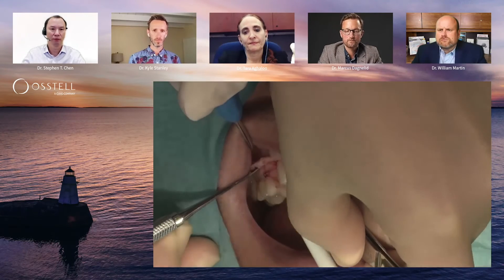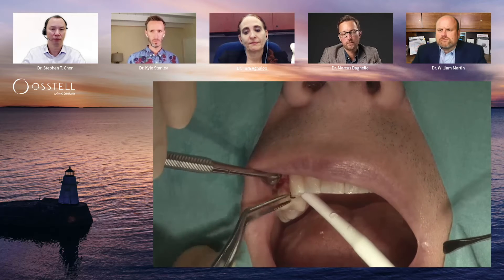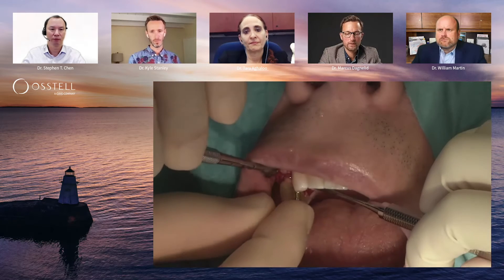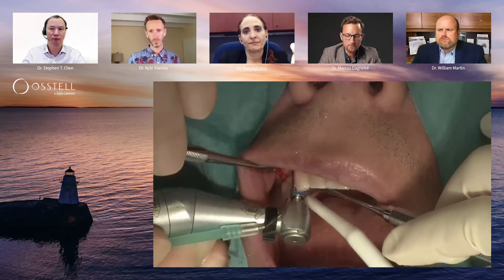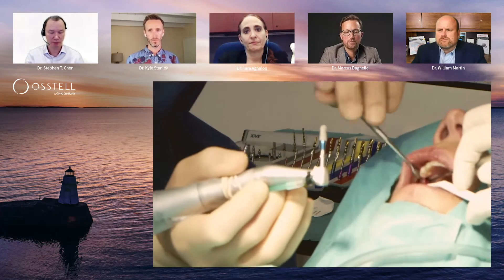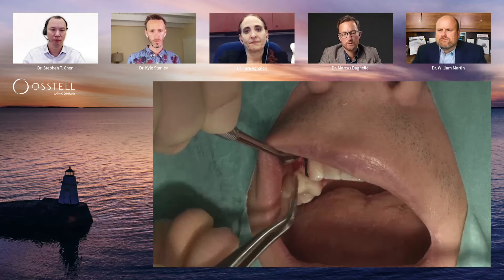Here we see a short video looking at a first premolar case in the maxilla. This patient lost the tooth due to a longitudinal root fracture, and we had waited 16 weeks of healing, so this is a late implant placement. We see here the different drilling steps where we're going to place a tapered implant body — a 4.5 millimeter implant in width.